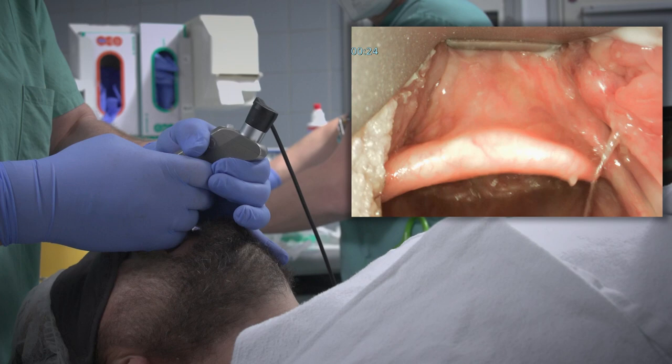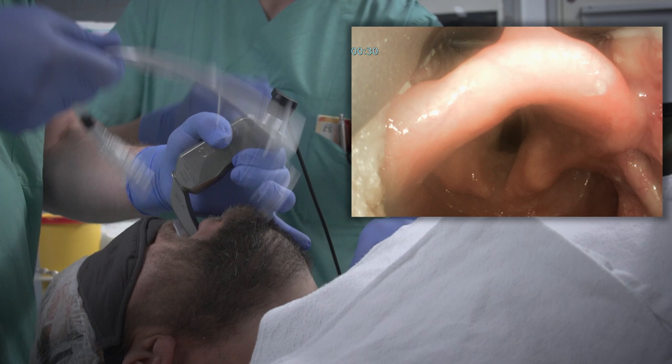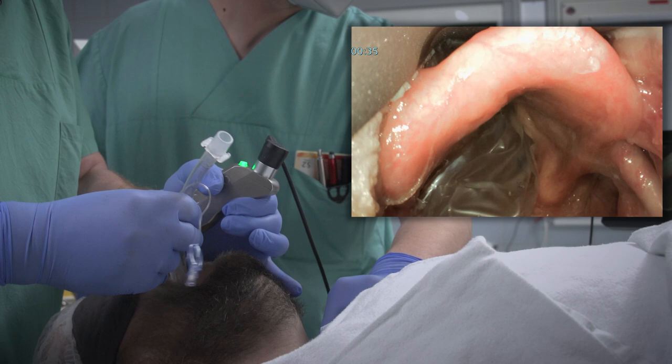Then you go gently inside the mouth to see the uvula, to see the tongue, and then going upwards ahead of the epiglottis. You can see the epiglottis very nicely, and then proceed to see the vocal cords.